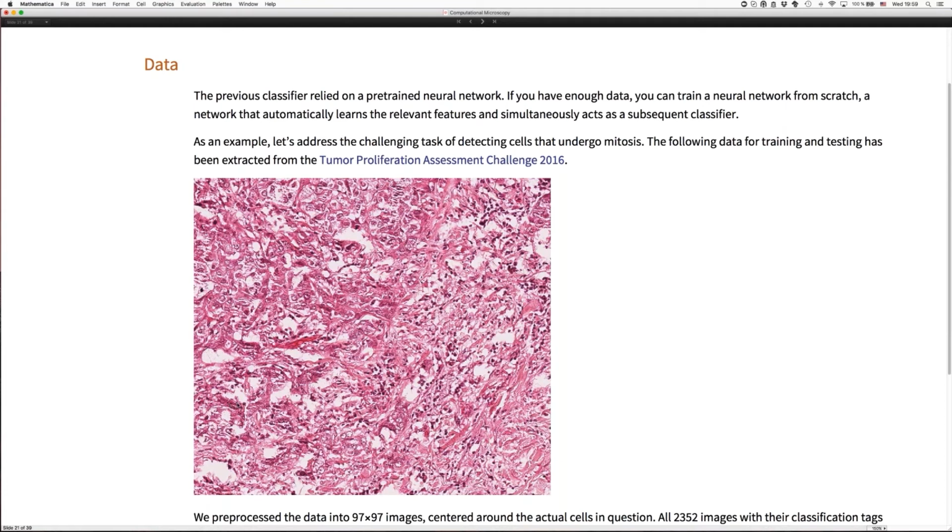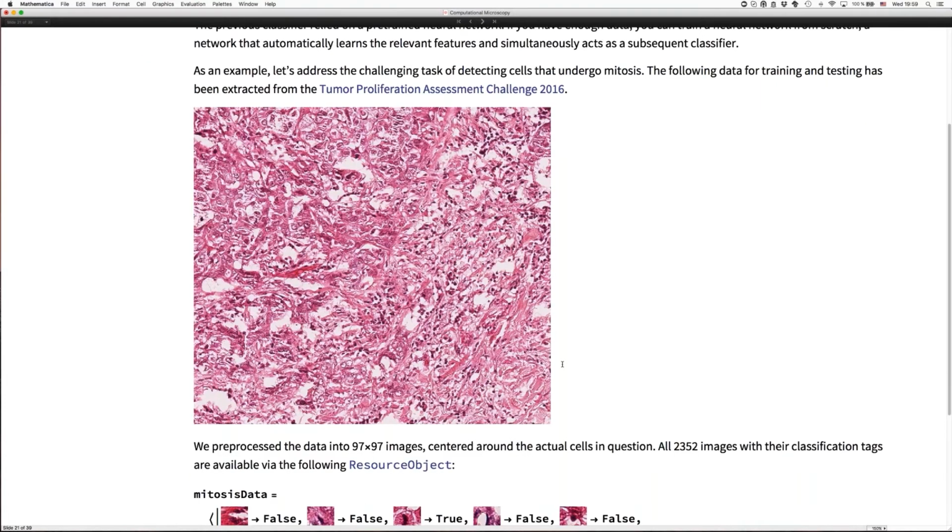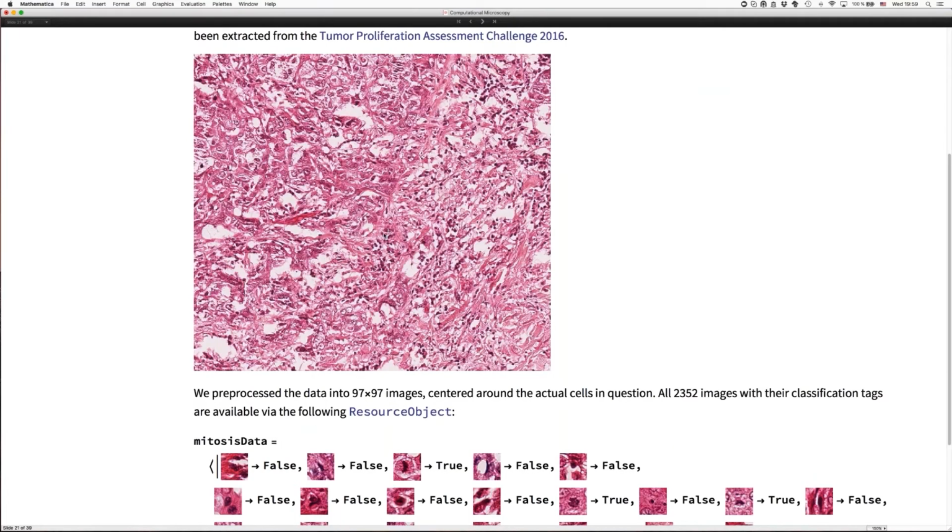The idea behind it is very simple. Cancer cells tend to divide far more often than ordinary cells, and if you have a high mitosis count, then that's a clear indication of having a malignant cancer in your tissue. The problem, though, is that finding cells undergoing mitosis is much harder than it sounds.